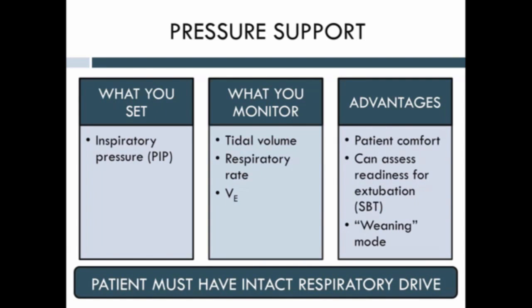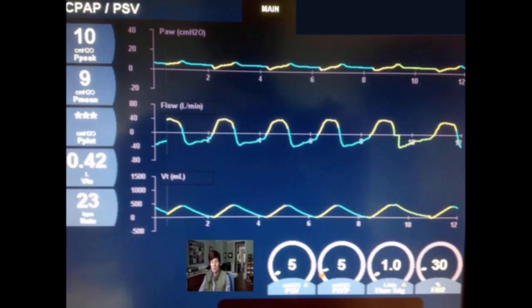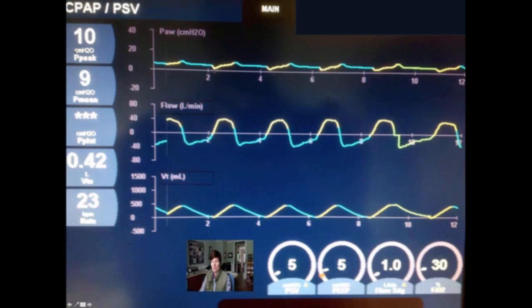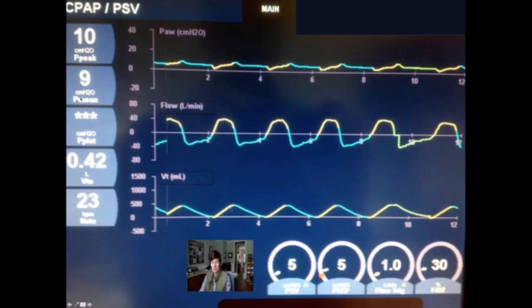Let's look at the pressure support waveforms. Here you can see that much less is set — only the pressure support, the PEEP, and the FiO2. The patient is taking a spontaneous breath every time, shown by the negative deflection. This ventilator indicates spontaneous breaths in yellow. The patient also helps determine flow based on how hard they're pulling against the ventilator, and receives an associated tidal volume.